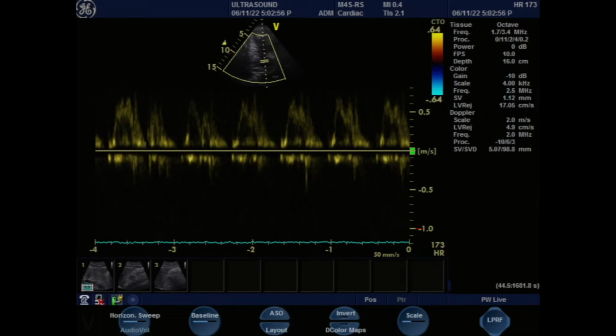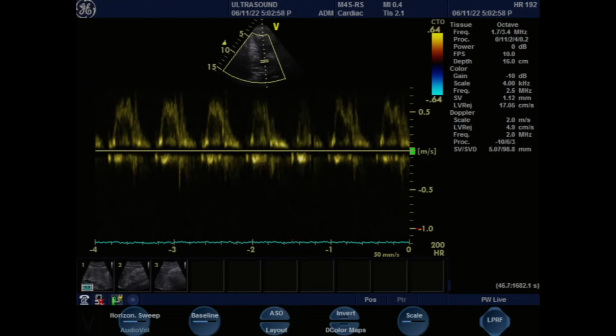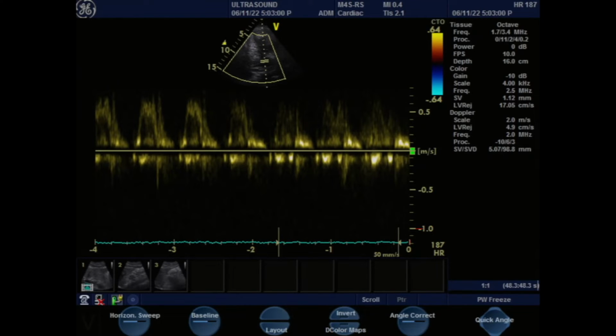So if you think about it, when the mitral valve opens, let's freeze one of these. So here what we're looking at is one mountain right here and the second peak, right? The first peak is giving an idea of the mitral valve opening and blood just going in by itself. And the second peak is when the atrium contracts, it fills up the ventricle. So it gives an idea of how the filling pattern is.